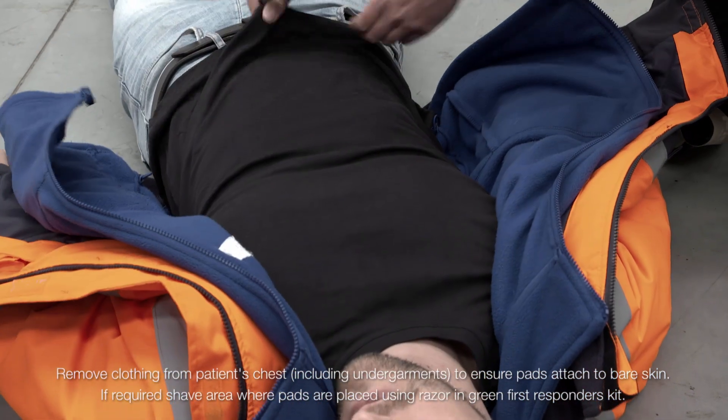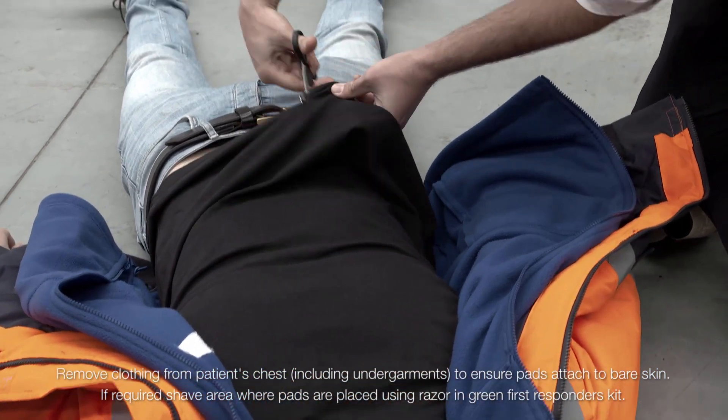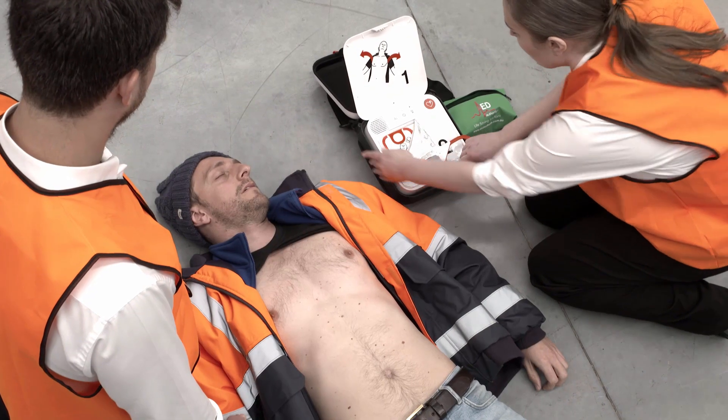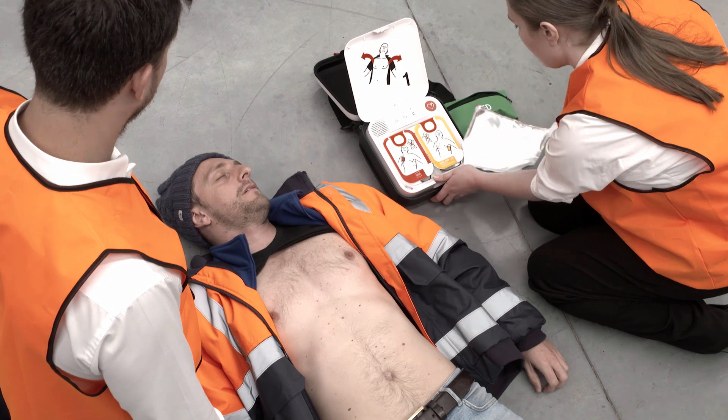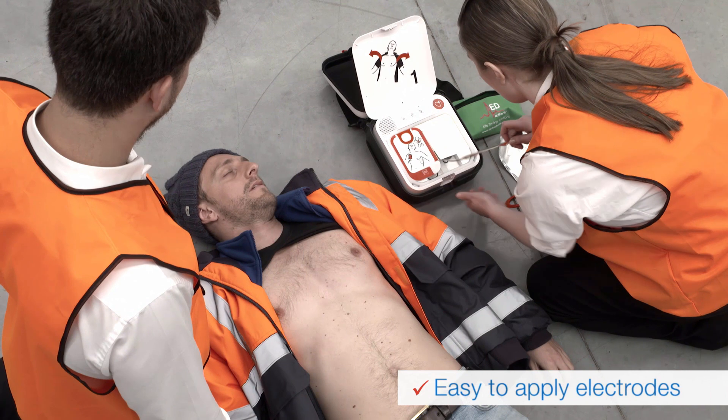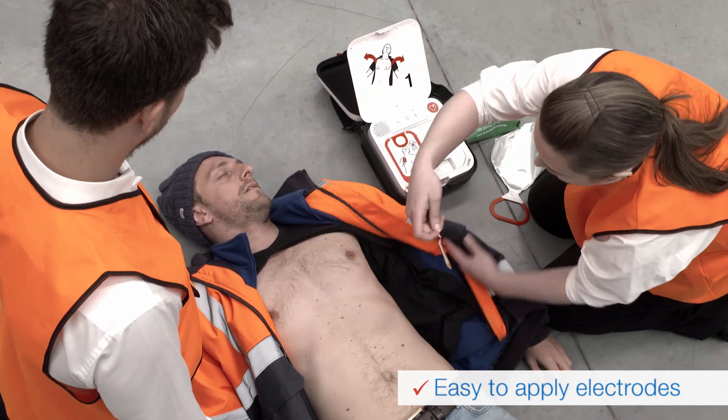Remove all clothing from the patient's chest. Pull the red handle to reveal pads. Look at the pictures on the pads and apply pads to bare skin exactly as shown in the pictures.